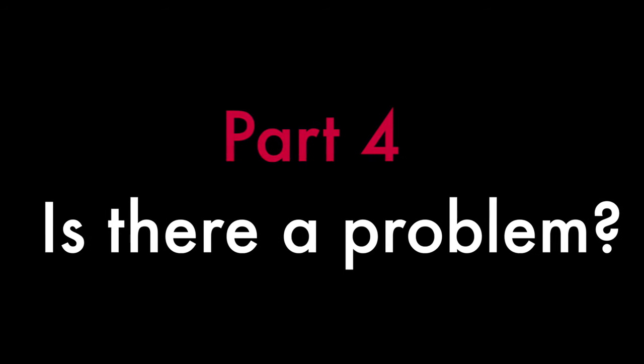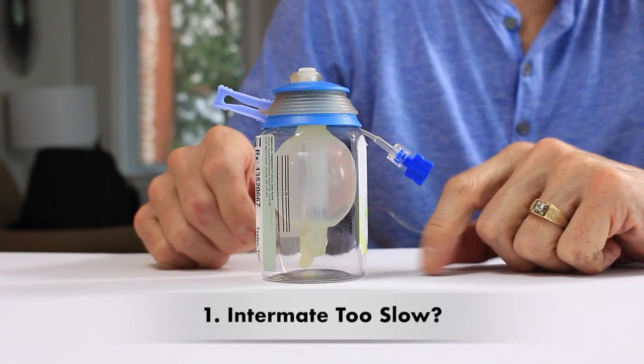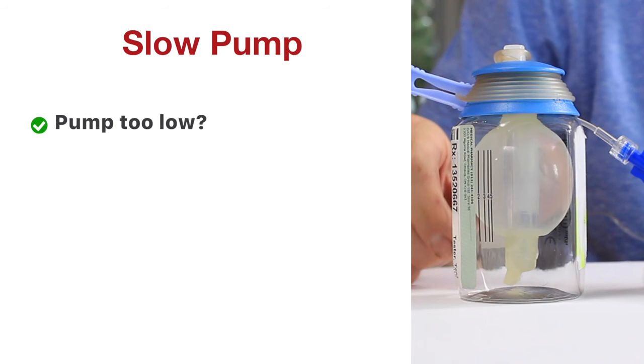Is there a problem? If your balloon doesn't empty at the time that it was supposed to and it's running slow, there are a few things that you can look at to see if it caused it to run slow. Was the pump too low? Remember, that pump needs to be around the height of your arm, around the height of your pec. So if you set it down on the floor, it's going to run slowly.